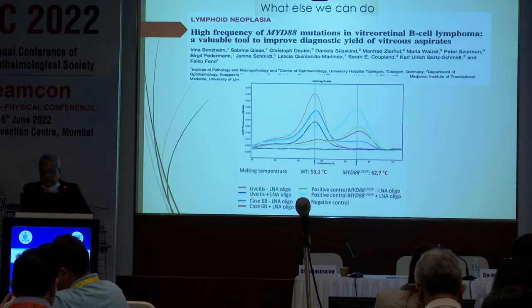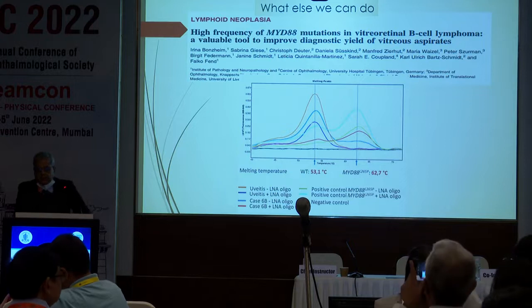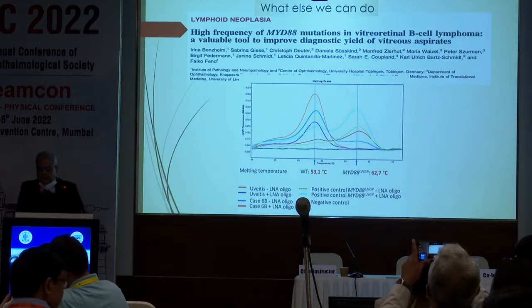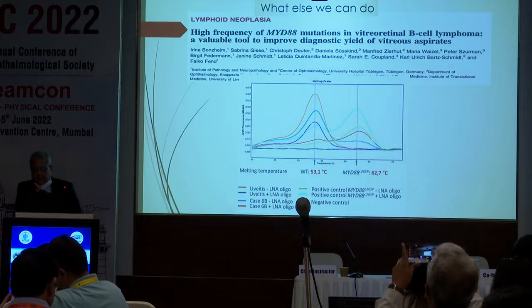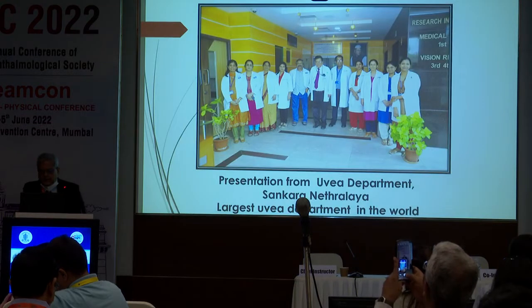Last but not least, we are doing MYD88 L265P mutation testing, which is useful in vitreoretinal lymphoma, and we can detect the spike in the DNA gene sequencing. And lastly, I conclude that as is your pathology, so is our practice.